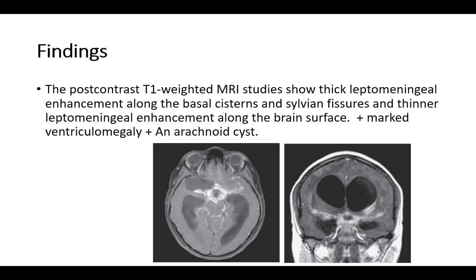In these images we can see thick leptomeningeal enhancement along the basal cisterns and sylvian fissures, with also thin leptomeningeal enhancement along the outer brain surfaces. Also noted is marked ventriculomegaly with an incidental arachnoid cyst in the anterior right temporal lobe.